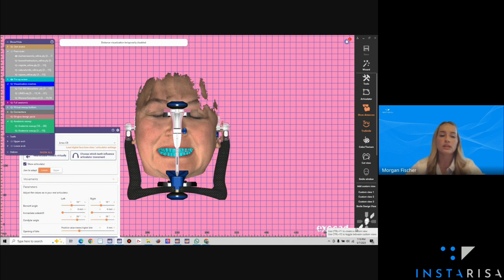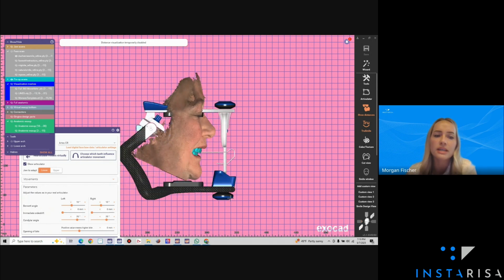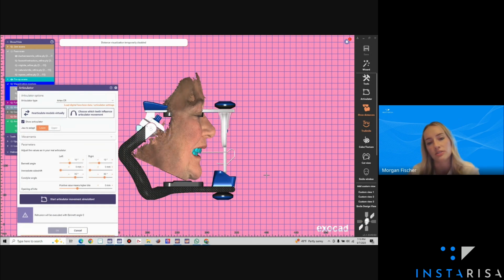And I'm a lot more confident using the virtual articulator, knowing that it's not going to mess up my bite because I'm mounting everything off of the facial scans here. This is another level of communication that you will have with the designer. If maybe on the day of surgery you weren't able to do as much bone reduction as you were hoping, we're still searching for some restorative space. We can open the bite virtually, that's no problem.